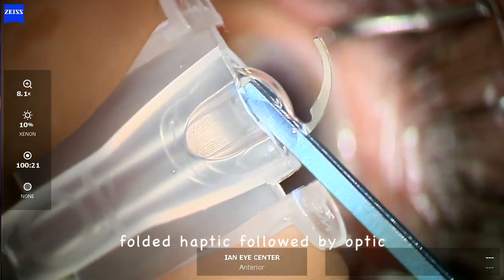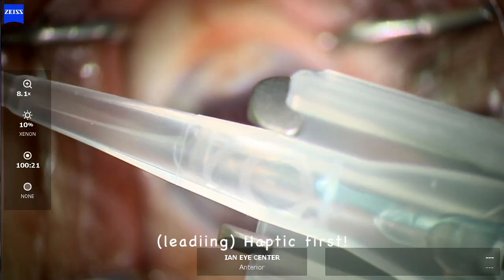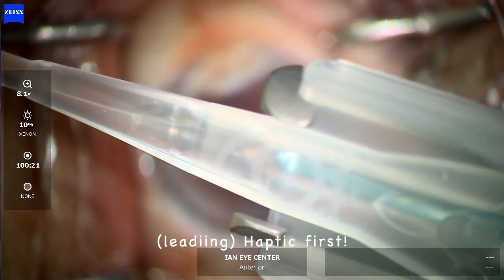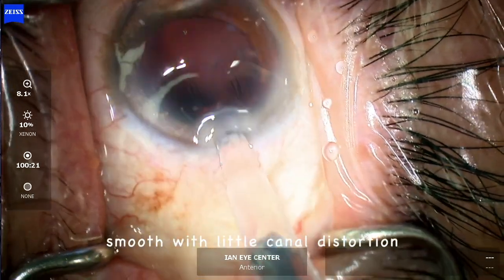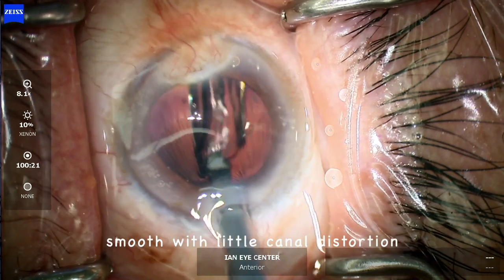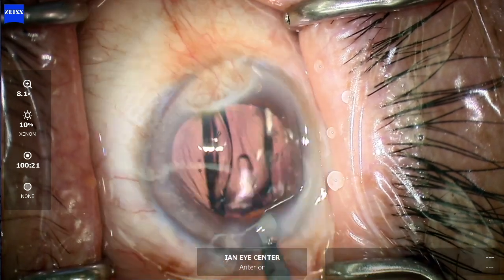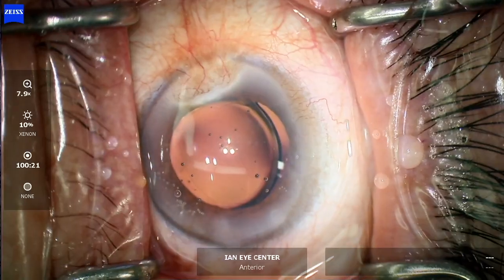To overcome this issue, I have found that folding the haptic and optic separately can prevent kinking. By inserting the folded leading haptic into the cartridge canal first, followed by the optic, the insertion process becomes smoother with no kinking or resistance.